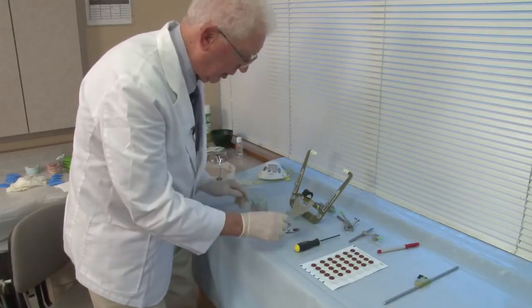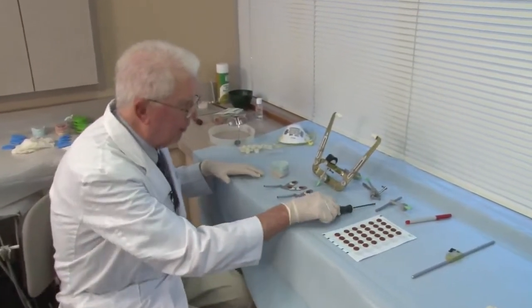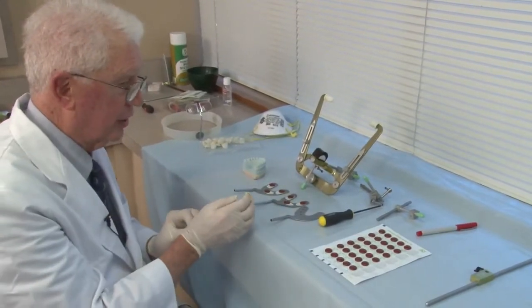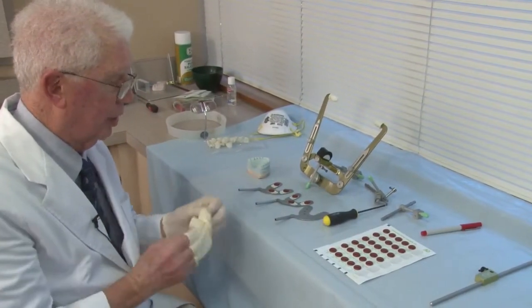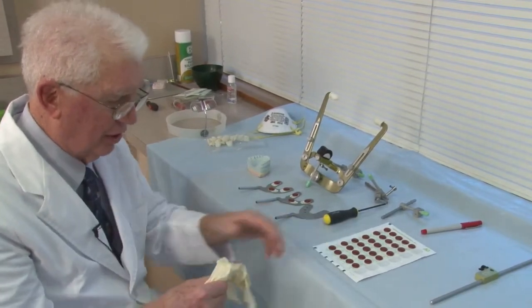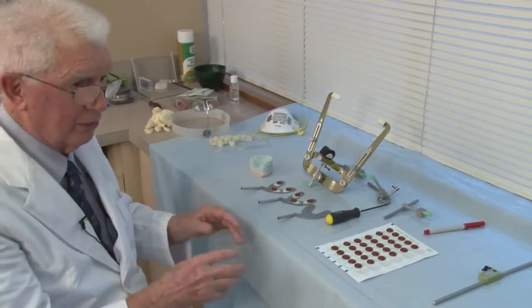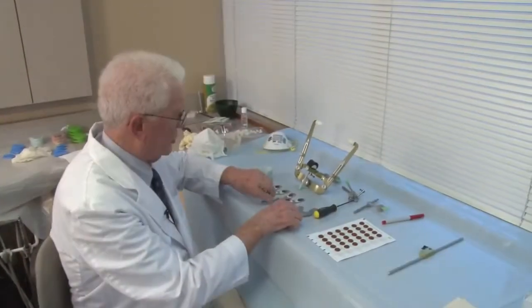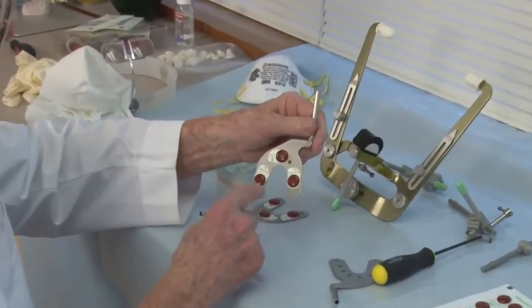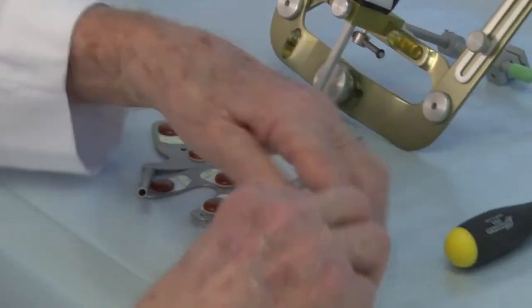I will show you how to now put the bite tabs on the bite fork. For this, I'm going to remove my gloves and put new gloves on when the patient comes back. This is so that the sticky part of the bite tabs, the AccuBites, won't stick to my fingers as readily. So we know where we want to place the bite tab, the AccuBites, on our bite fork.